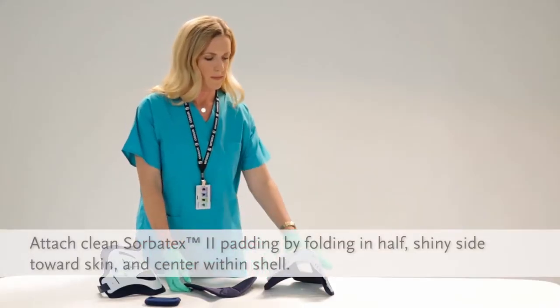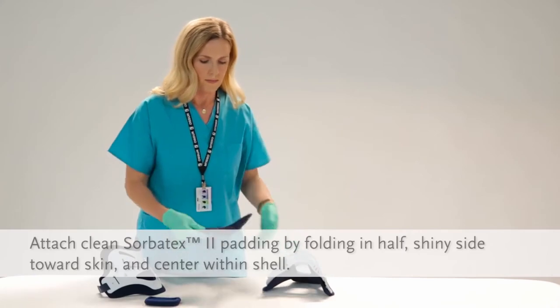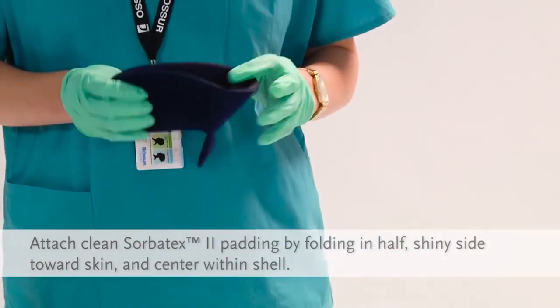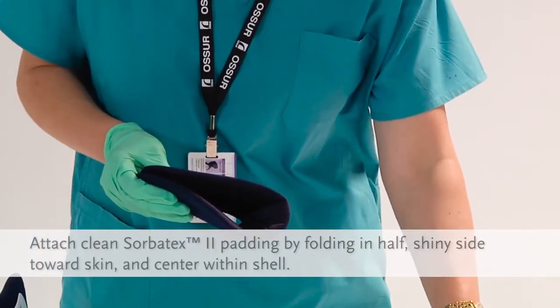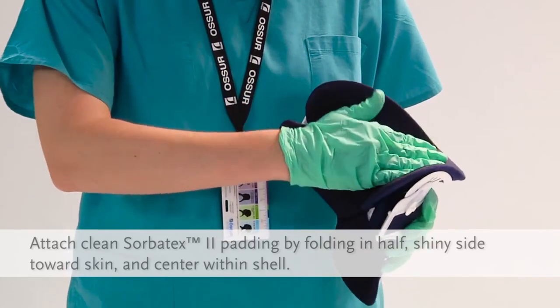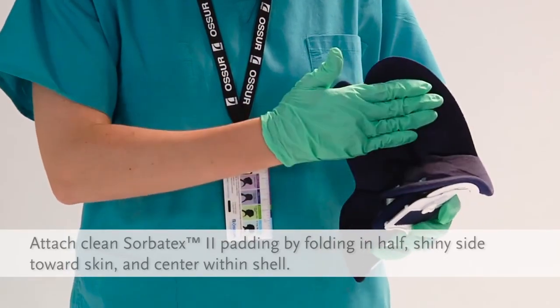Place the clean set of Sorbitex 2 pads in the collar front. Fold pads in half with the dull side next to the velcro. The shiny side should go towards the skin. Then center the pad in the white shell. Adjust the pads as needed to make sure no plastic touches the skin.